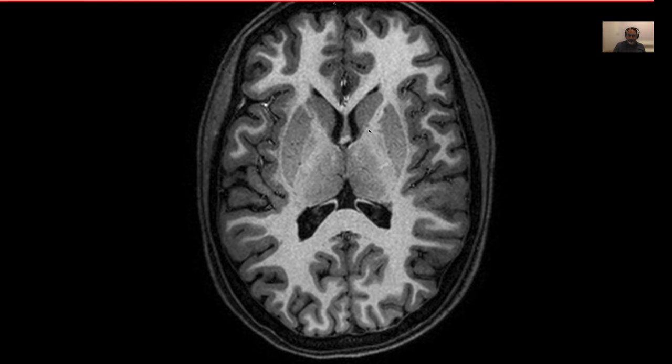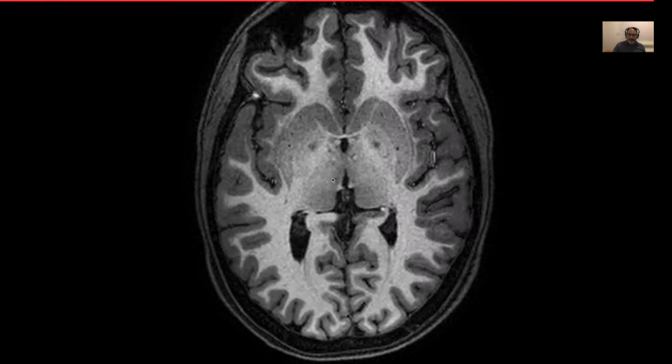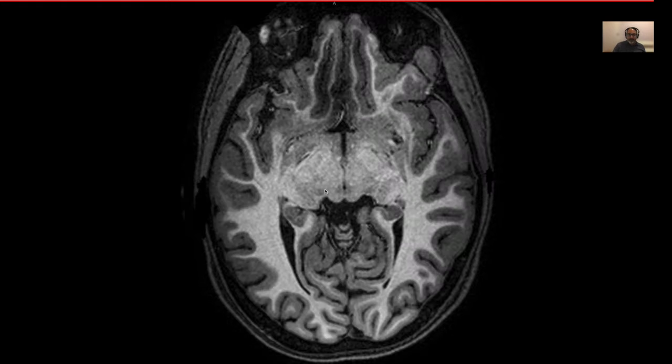And so that's basically the internal capsule, both sides. Again, that is the caudate nucleus, putamen, and globus pallidus is right next to that here. And the thalamus is here. So let's just keep moving further inferiorly. And as you can see, further inferiorly, those structures continue onwards. And now you are moving down.